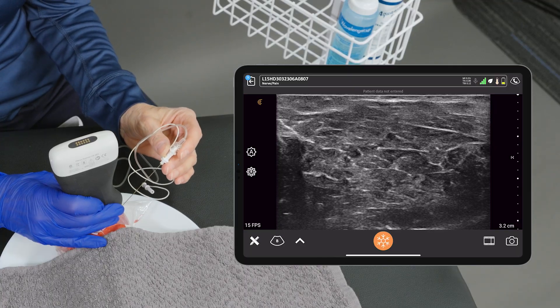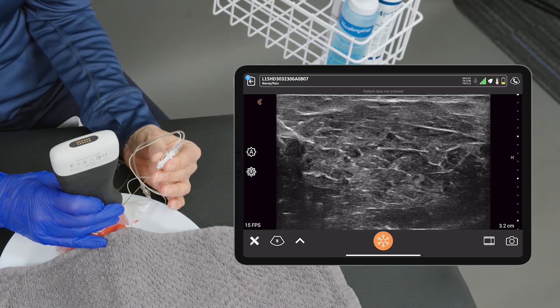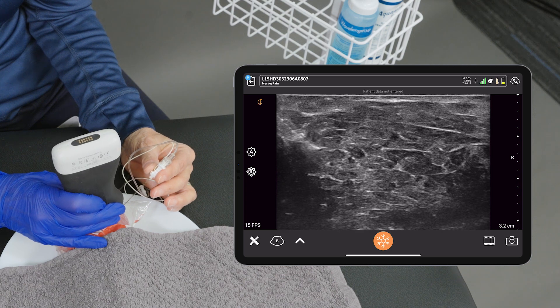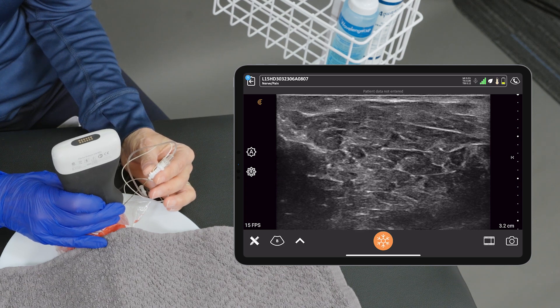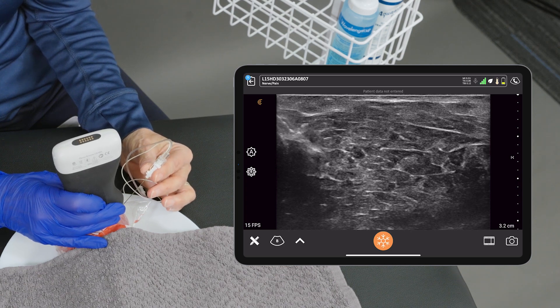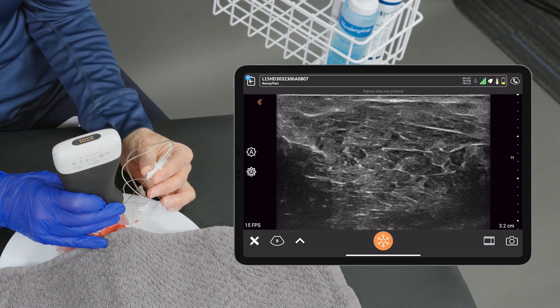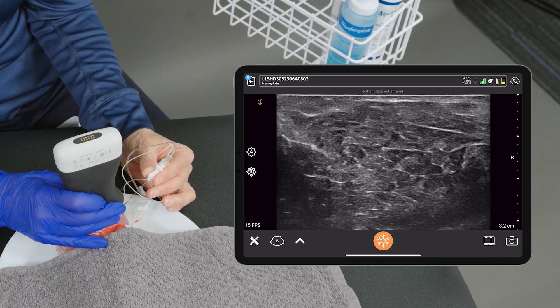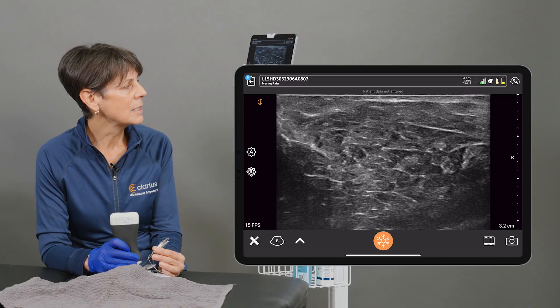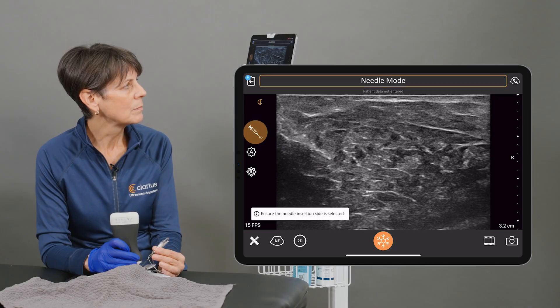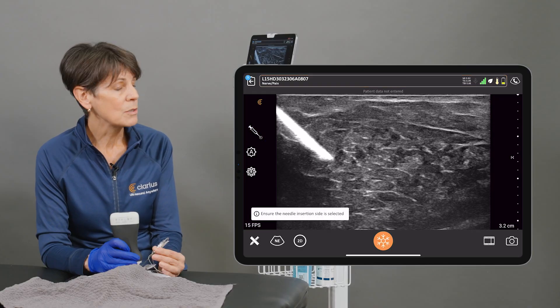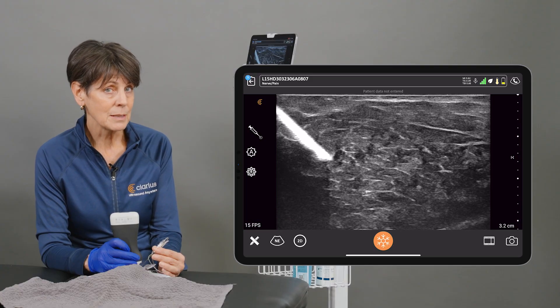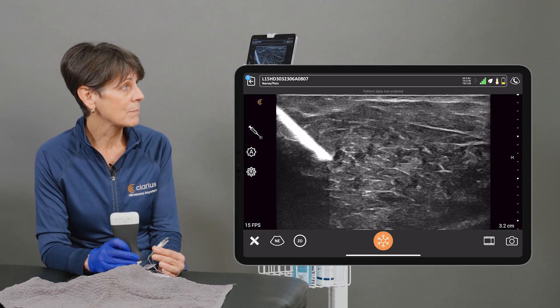So if you're doing a steeper injection, I can have an idea of where my needle is just by looking at the different tissue, but if I activate Needle Mode using my voice controls, it really lights up the needle quite nicely.